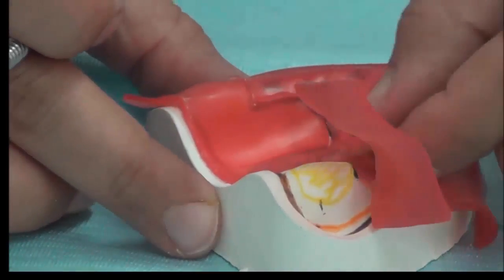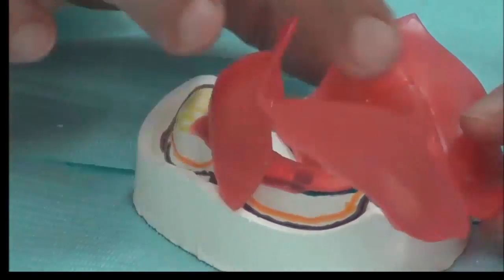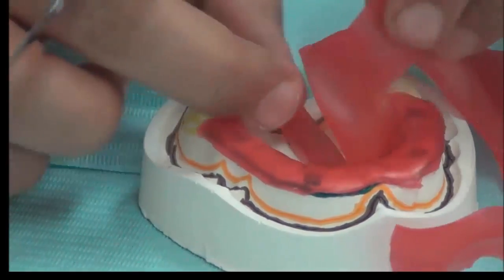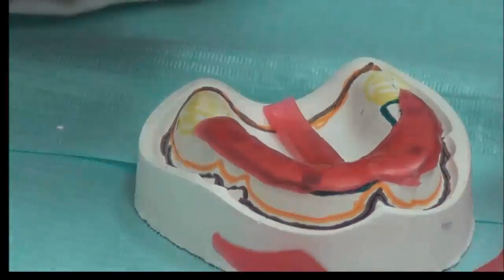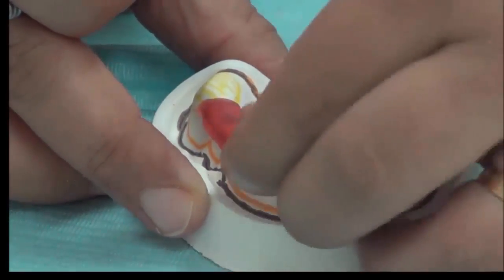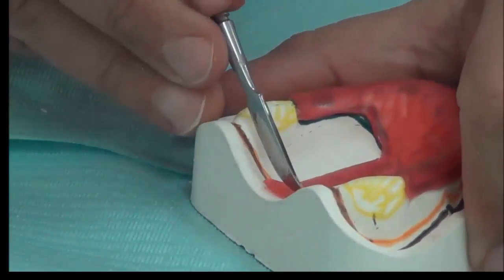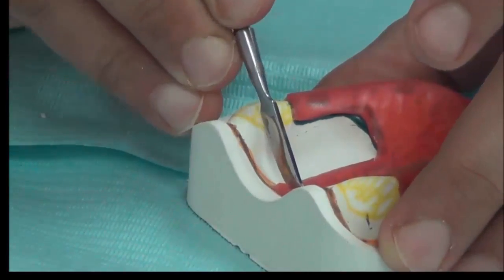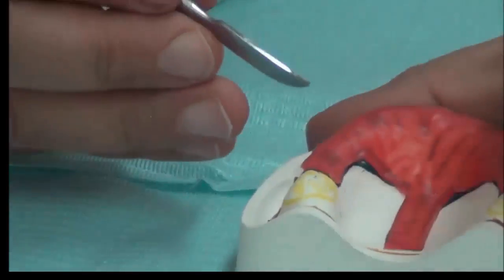You notice that the wax is still warm, so after I remove the excess, I could still adapt the material even better to the borders that I have placed. A bit short from the border area, just a bit short. Then I'm opening the boxes.